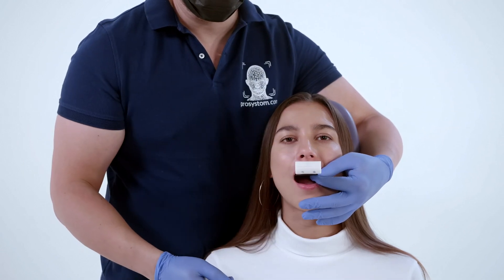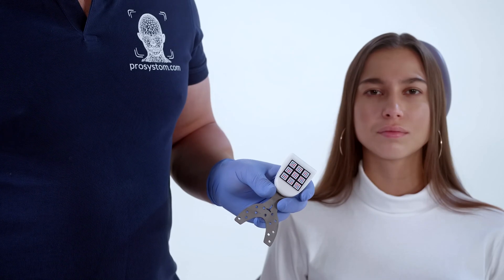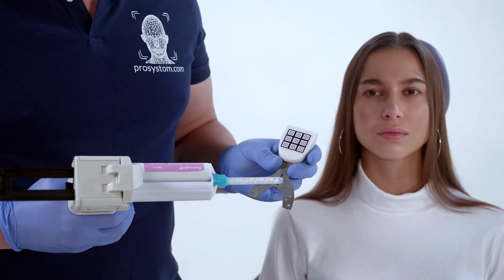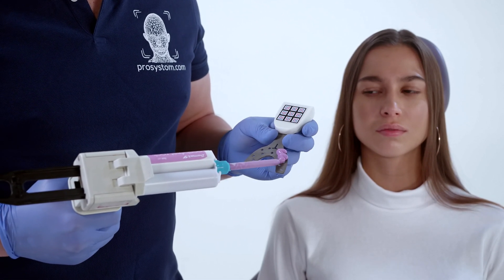Next, we apply a silicone register on the bite fork and fix the fork to the dentition.